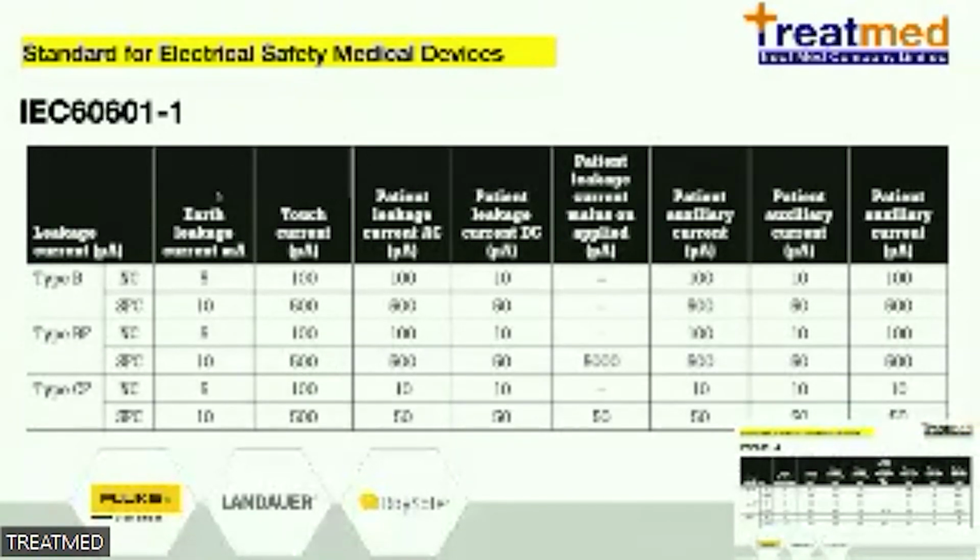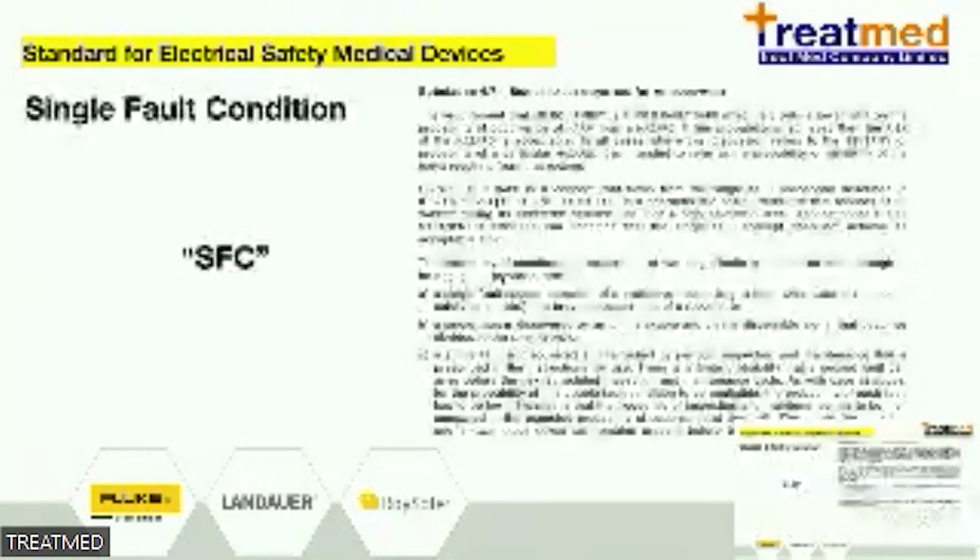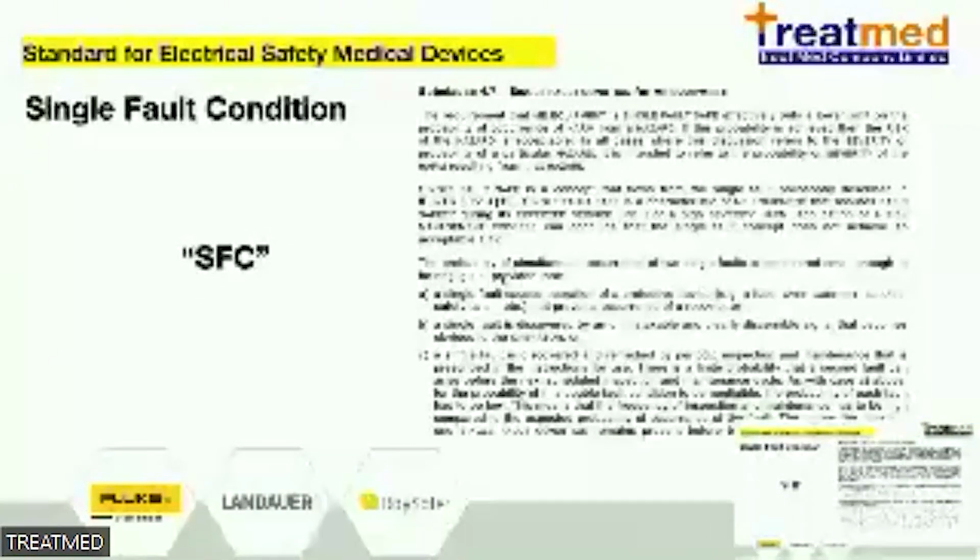This is a table from IEC 60601. You can use it for acceptance testing when you first receive a medical device. Okay, this is the explanation about the single fault condition, found in the IEC 60601 in clause 4.7, for the single fault condition of medical electrical equipment.